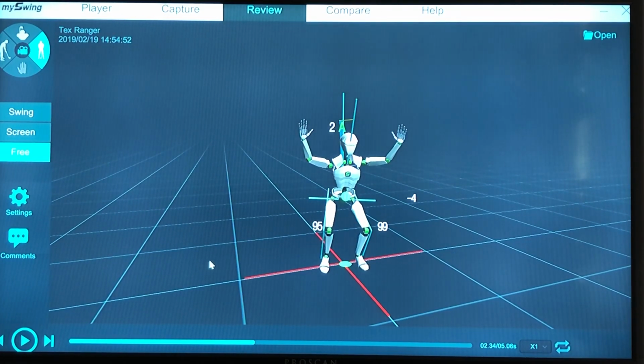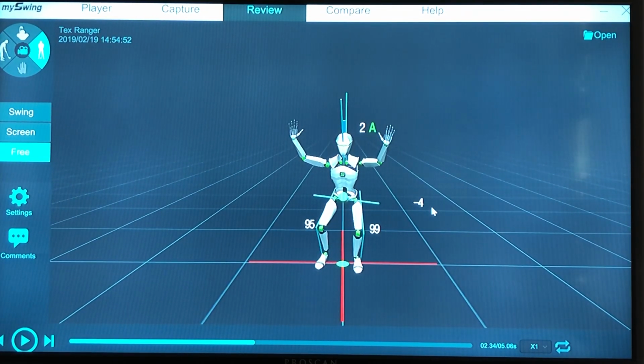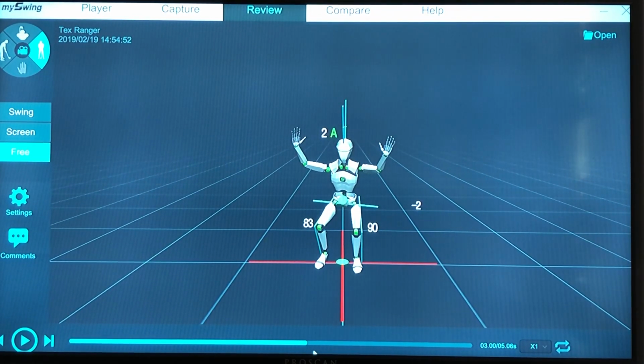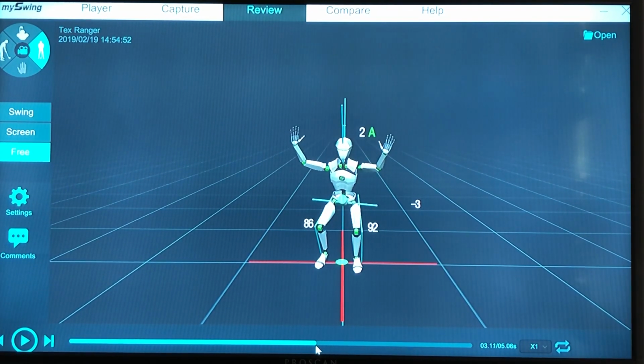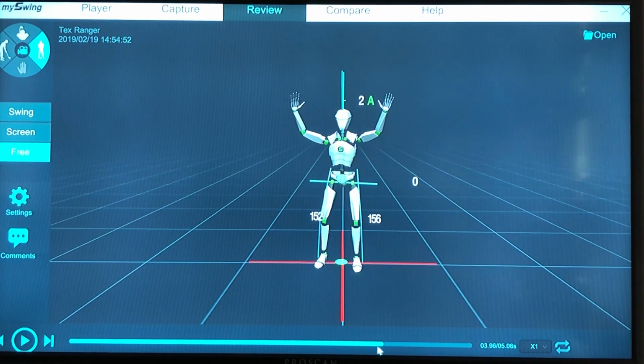As he goes down, though, notice the pelvic tilt over here. 4 degrees down on that side, it's going to get even more. So he kind of stabilizes here, but he's tilted back over this way to the right side to keep the center of mass centered. And you can see there's a difference in those knee angles. As he comes back up again, though, he's able to recover to that. So there's definitely something going on there.